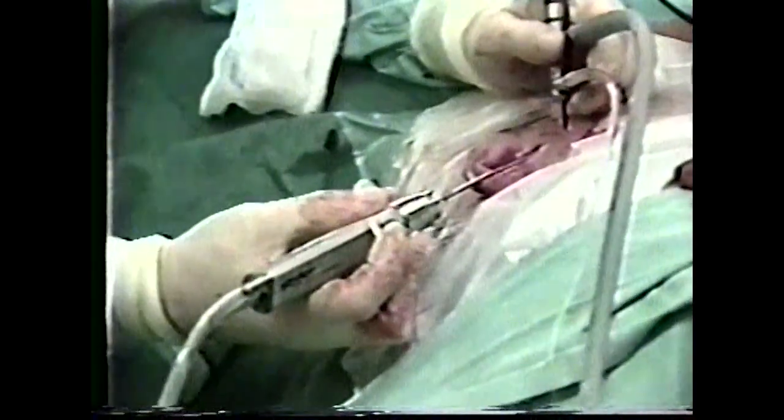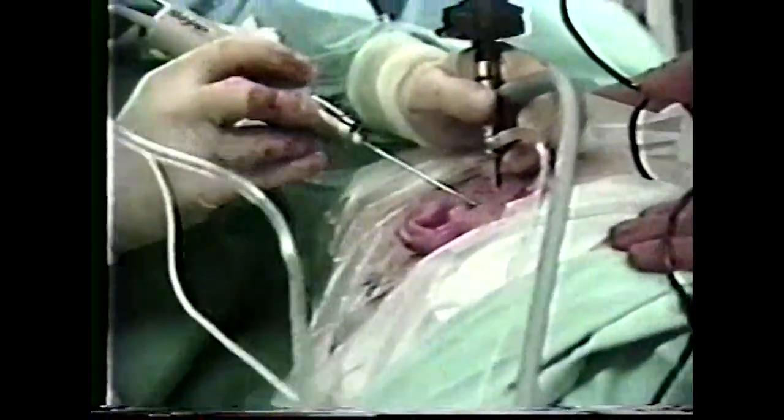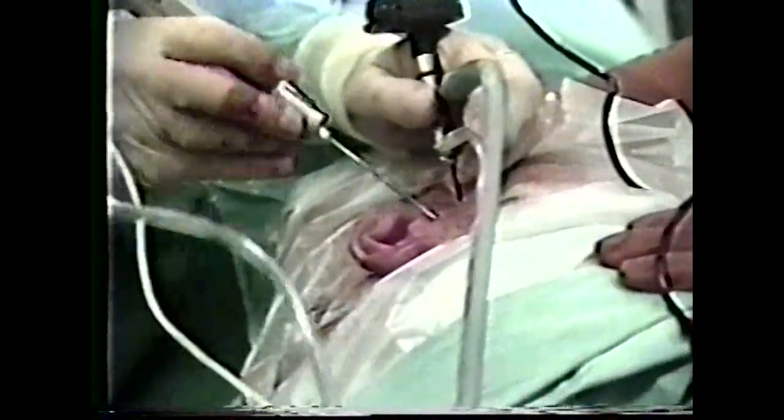In these examples, a cup forceps and a power debrider are shown being inserted percutaneously through the infralateral portals.